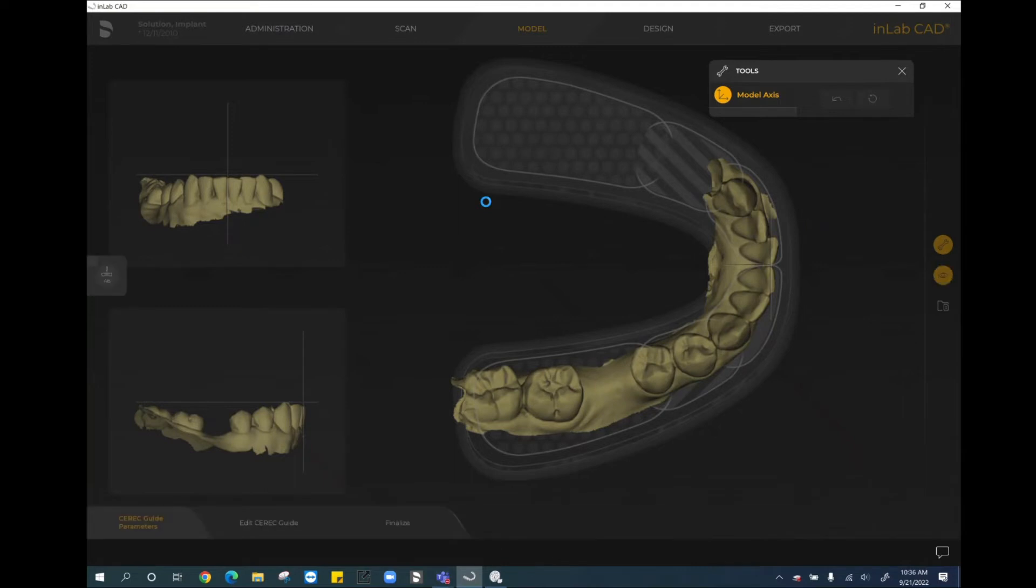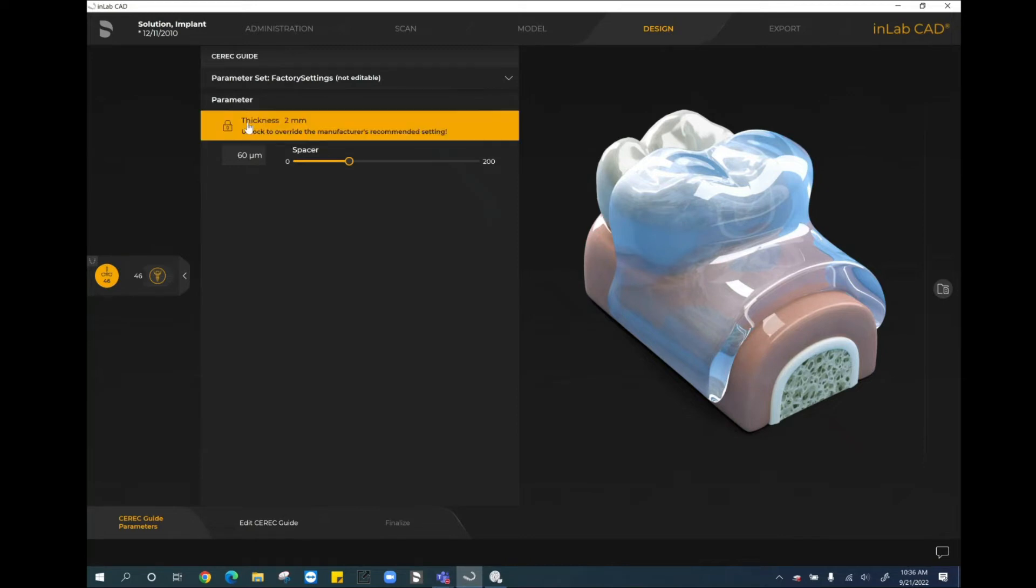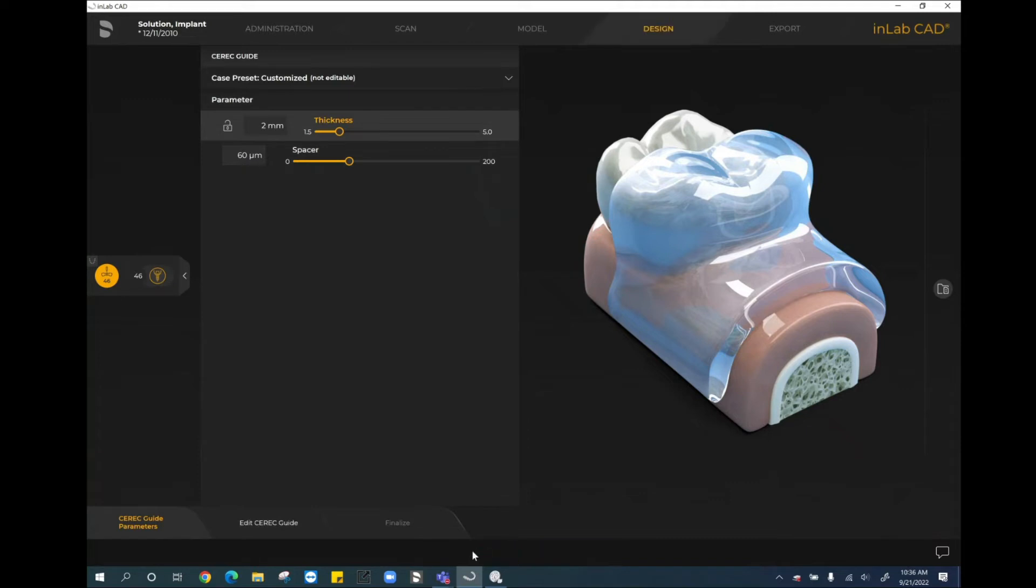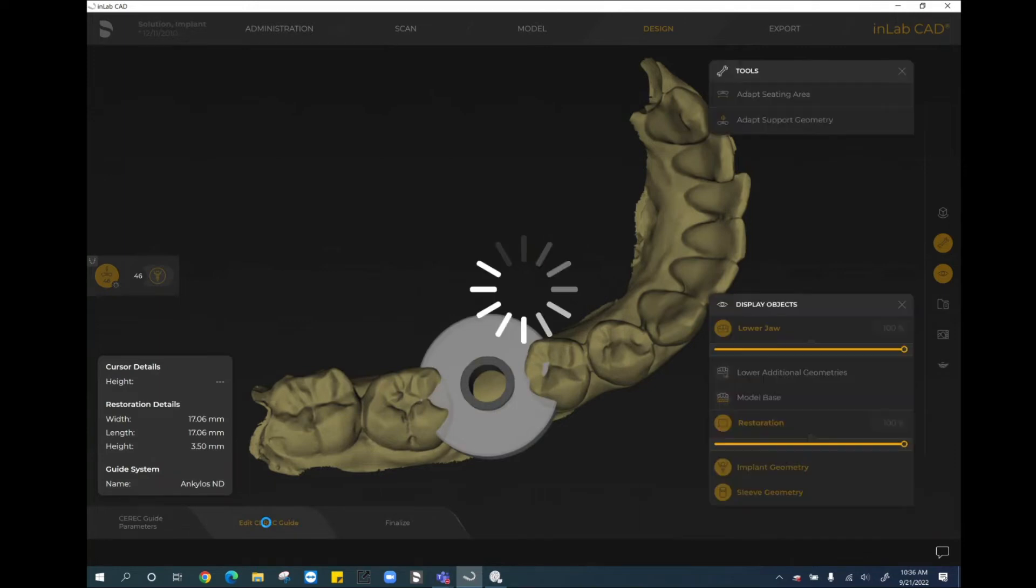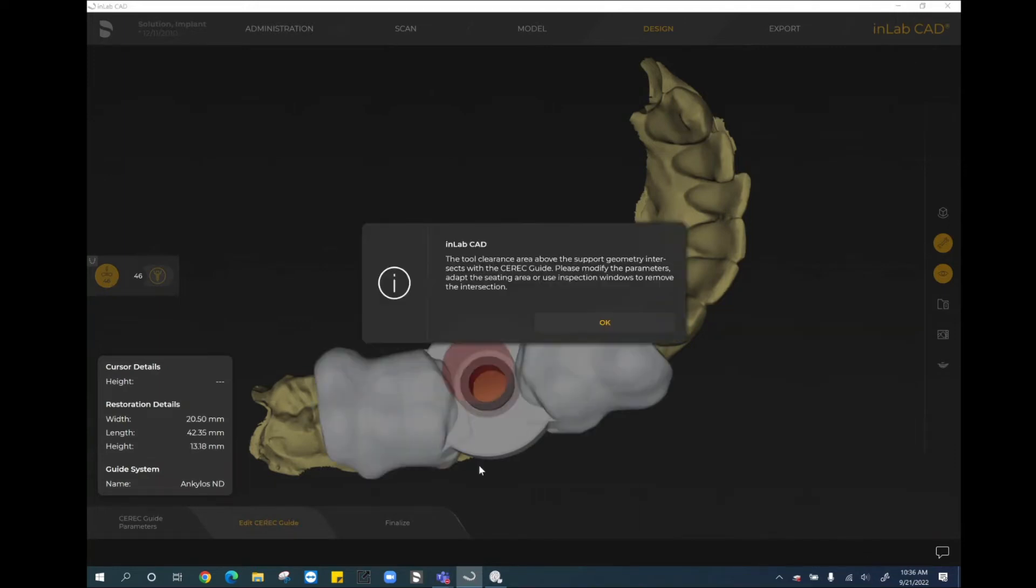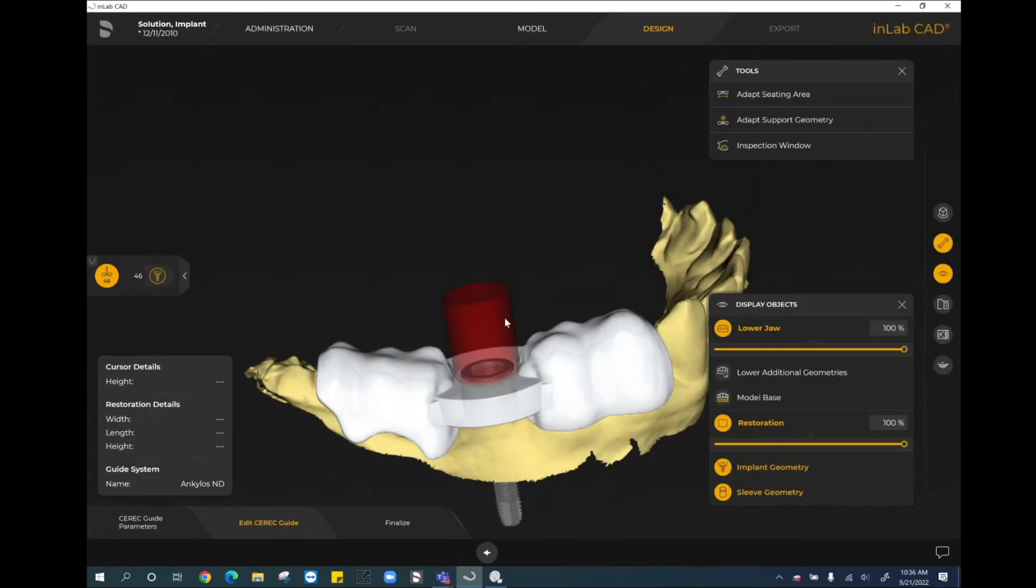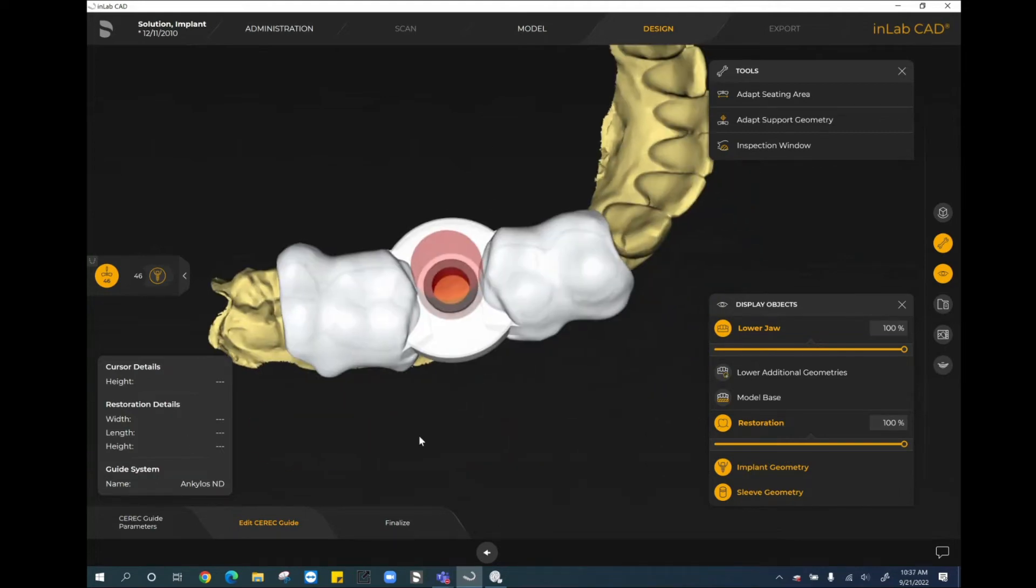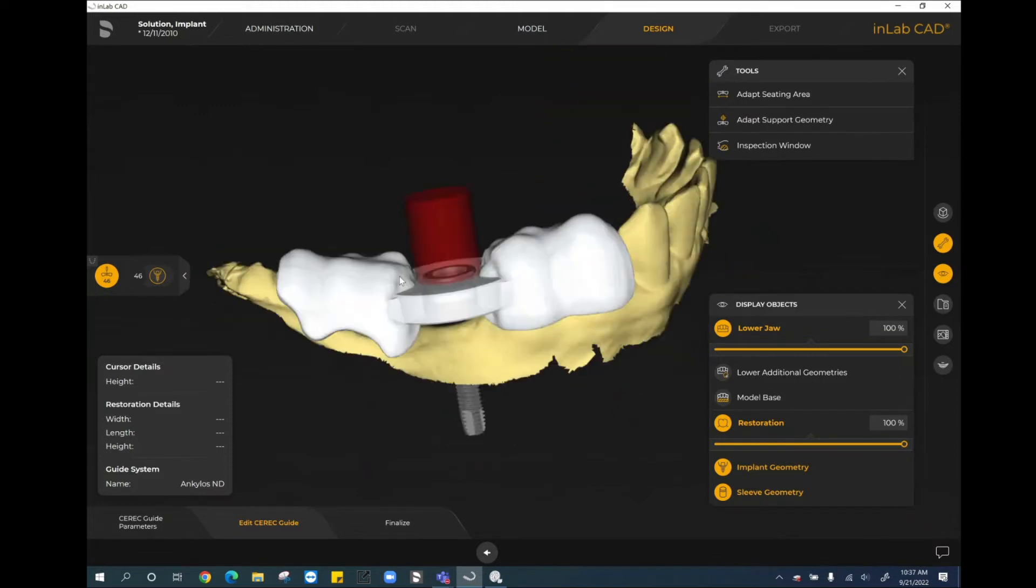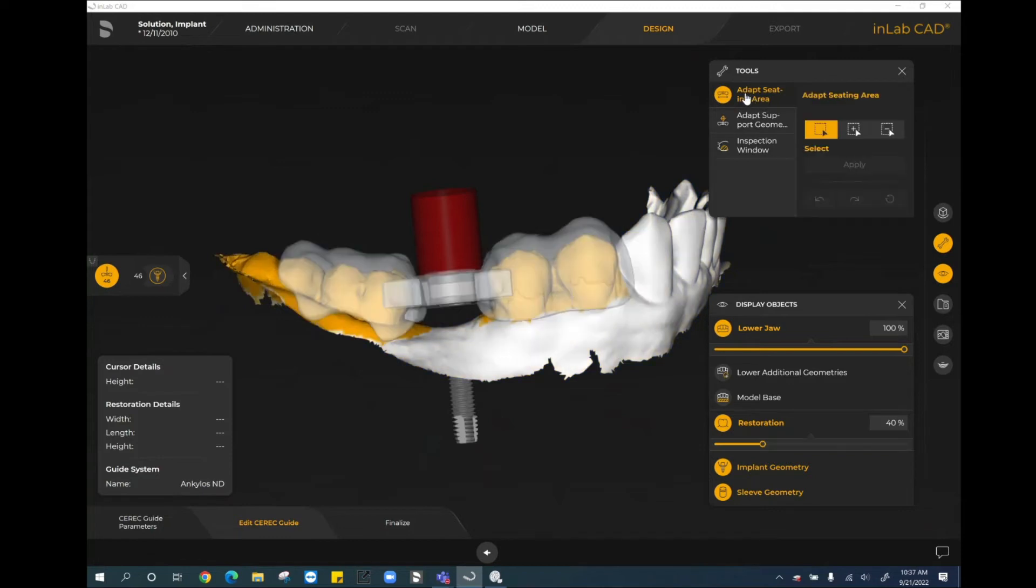Once you have your model axis set, we can move forward to the design. Much like in the InLab 20 or 19 version, it does a lot of the work for you. But if you want to change the thickness at all, you're more than welcome to. The spacer is kind of preset to one that's pretty decent for the Prime Print, so I wouldn't necessarily say that you have to change anything there. Where it comes to edits, CEREC guide, the system is going to generate a guide for us, but we have the ability to change a couple items. Right now we're getting that error message that's basically saying right now there's material that's impinging on the channel itself. So there's a couple things that we can do to basically get rid of that red to make sure that our drills in the actual surgical portion of this workflow for this patient we take care of.